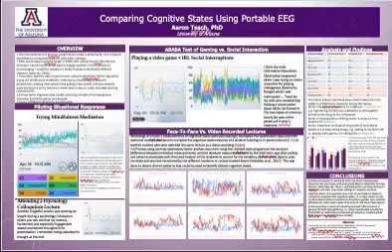And so I looked for things that would be cheap enough and portable enough so that we could experience that in the classroom. At first, I looked at maker websites to look for ways of putting together my own EEG.